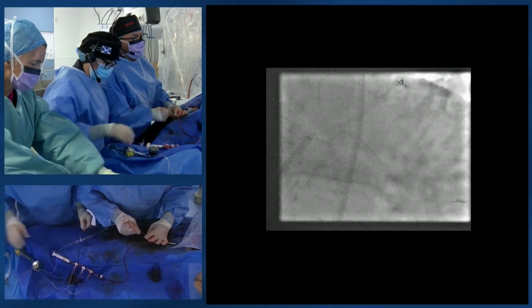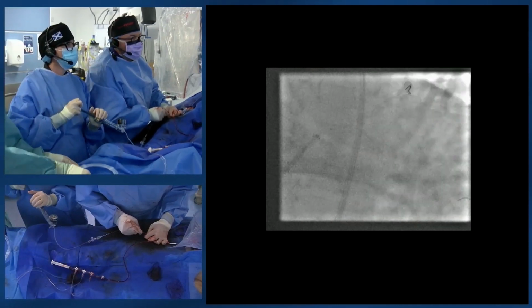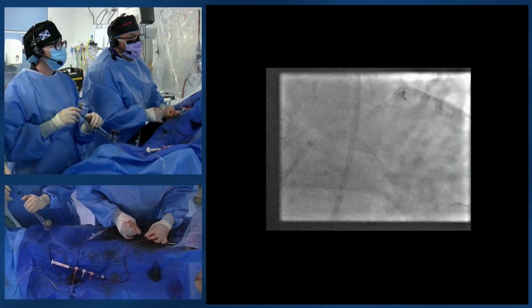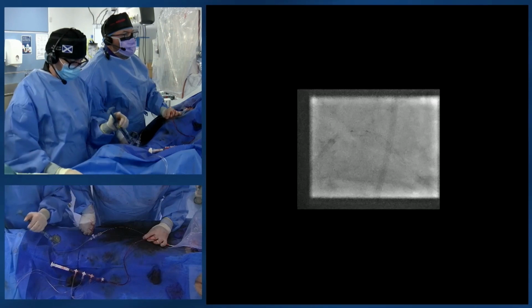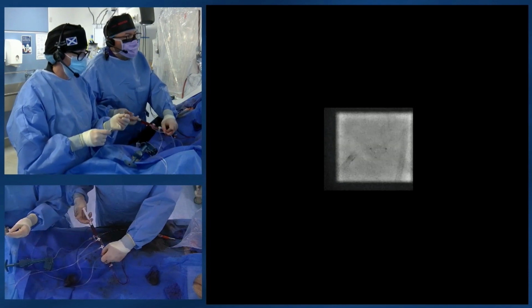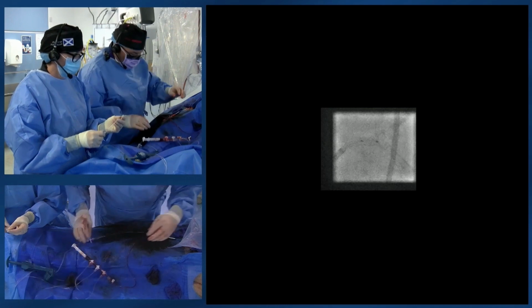For our proximal optimization, StentViz is excellent for these cases, so we're going to park the distal marker in the carina, and can we just cone in round there and we'll do a StentViz just to make sure we're in a nice position. So I'll give a little puff of contrast just to check that we're not way into the circumflex. That looks quite nice actually.